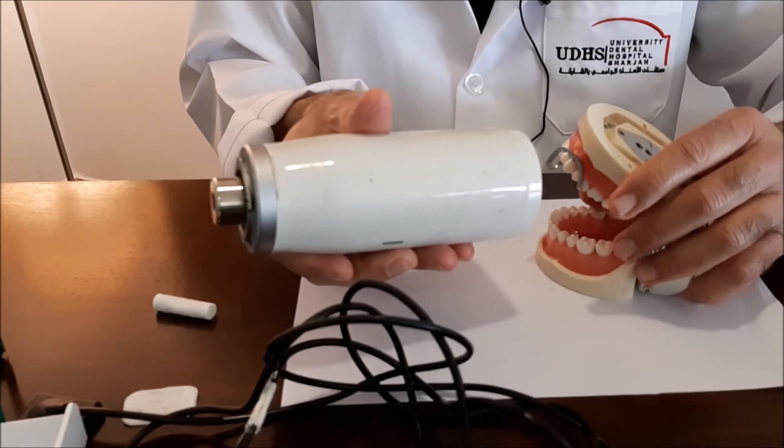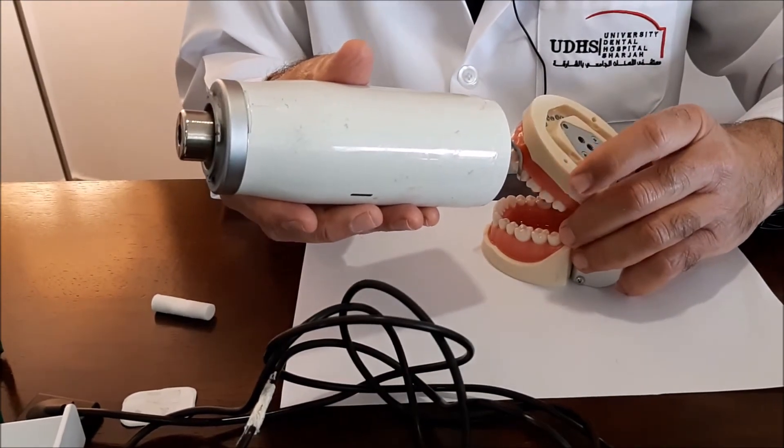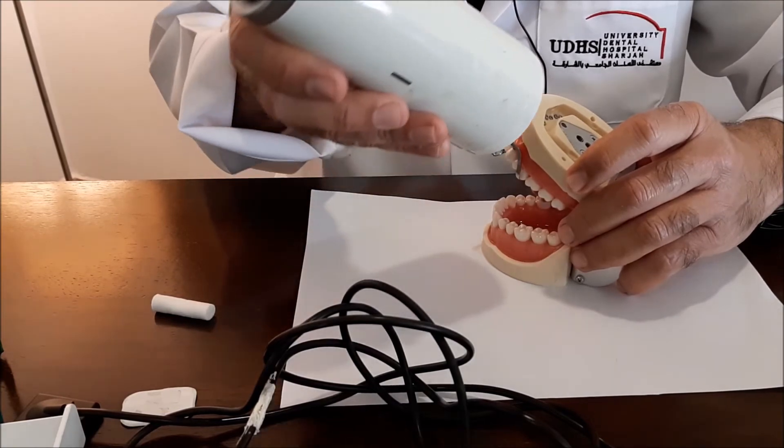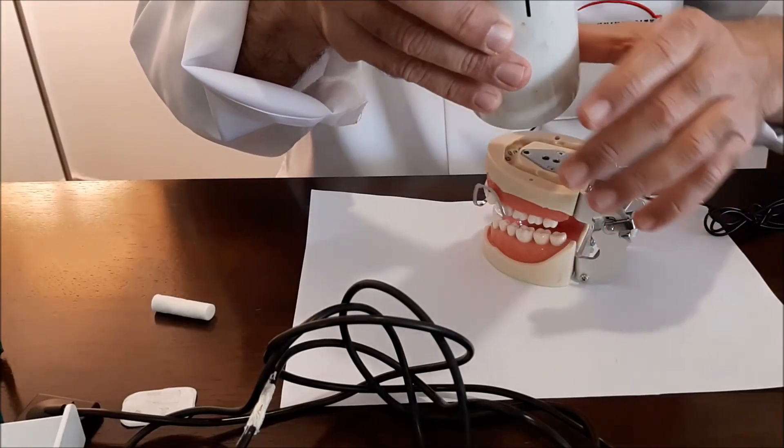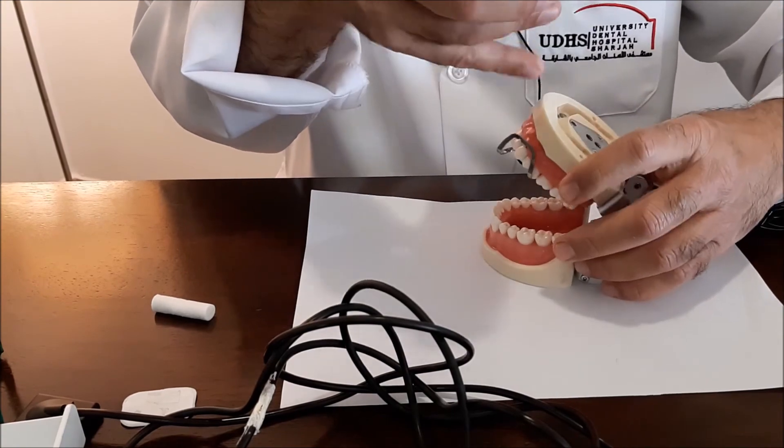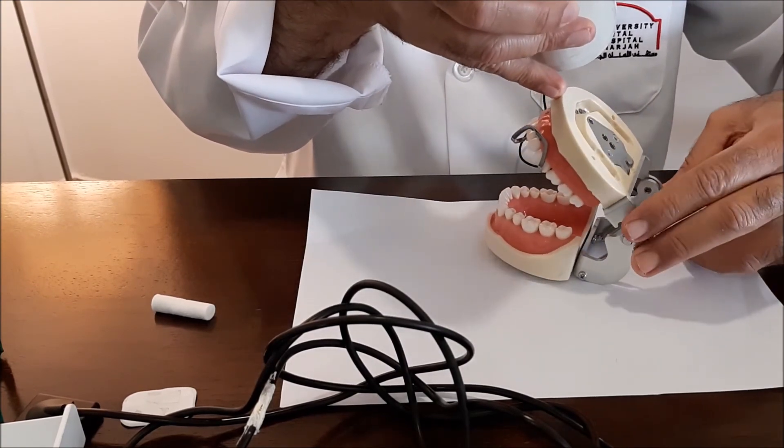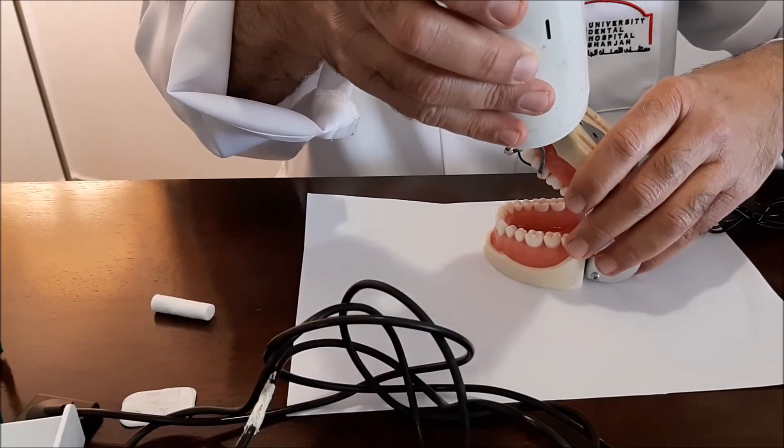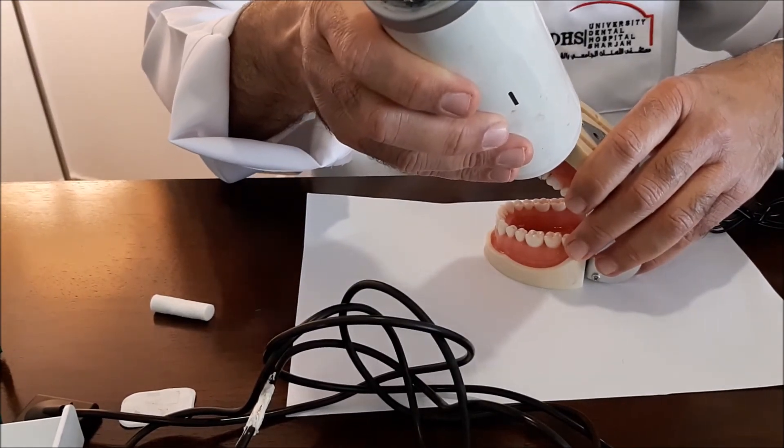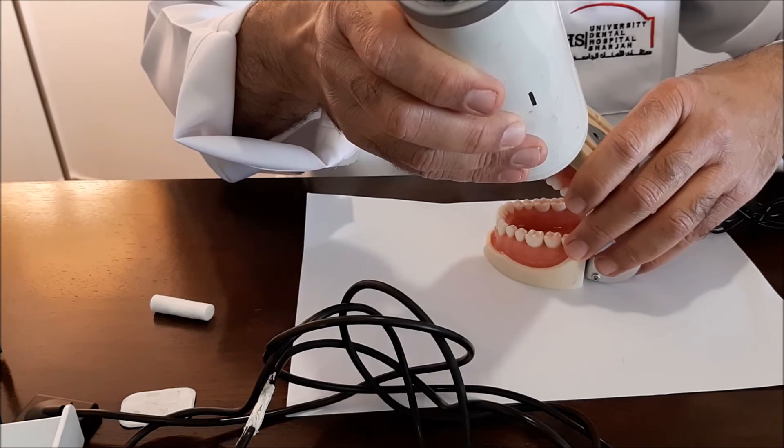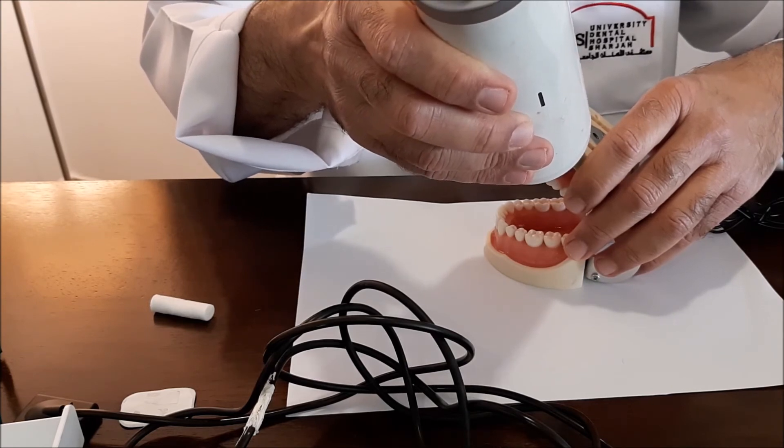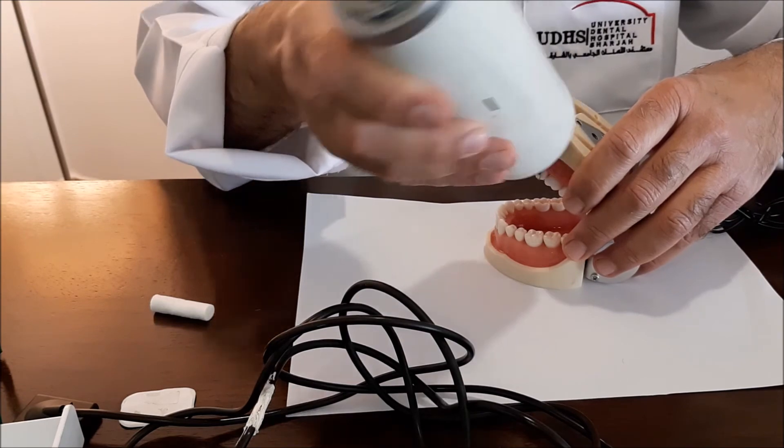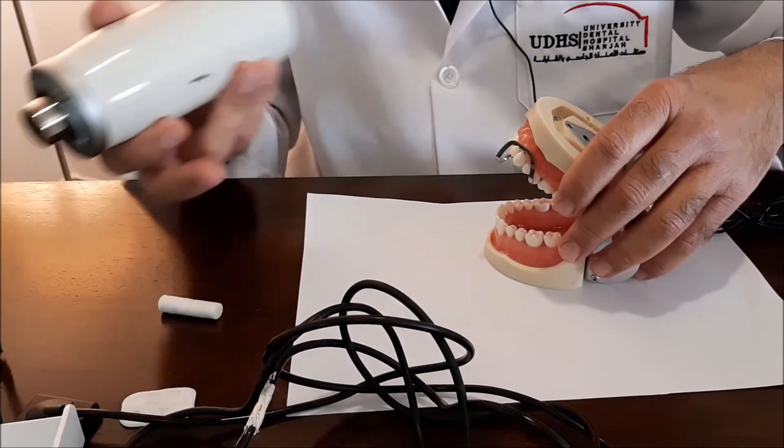So if we're doing like for the canine, just like we agreed earlier, you place it perpendicular on the tooth, then you place it perpendicular on the sensor. This is if you're not using the cotton roll, and then you keep it midway, an angle of around 45 to 50 positive angulation.